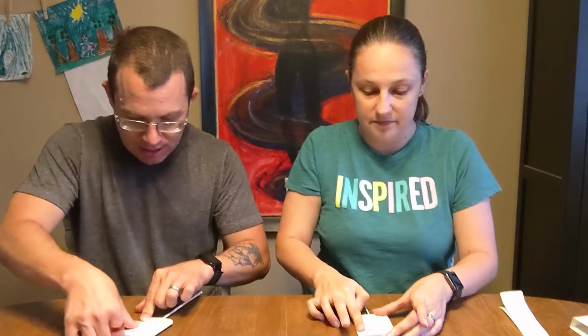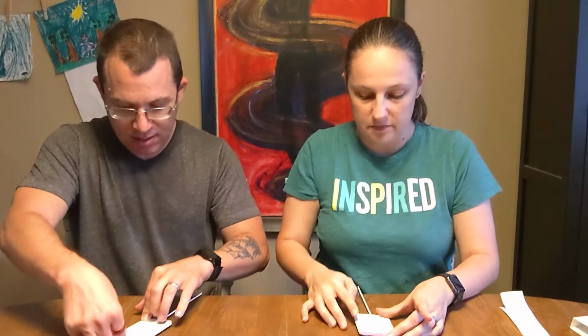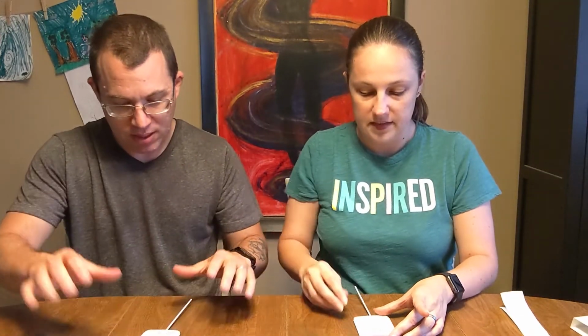Just like that. Seal it nice and tight. Now we set a timer for 15 minutes. Don't touch a thing. This is going to be a ridiculously long 15 minutes. I'm just telling you right now. Thankfully, you're not going to wait this whole time. 15 minutes. We're going to end.